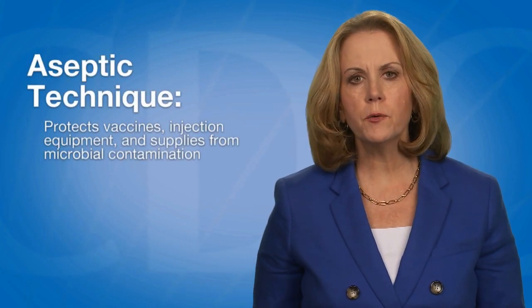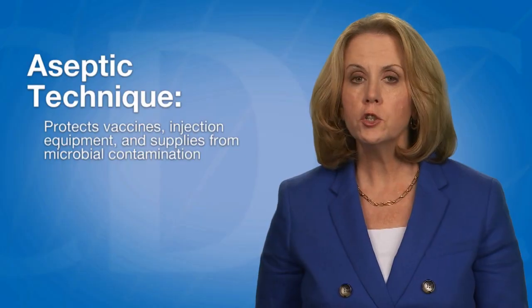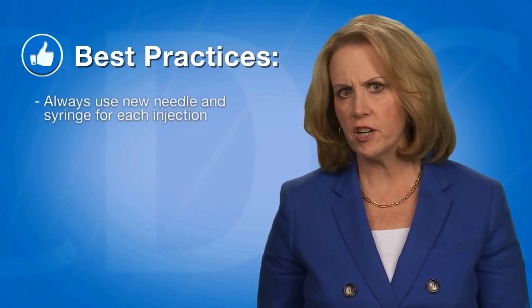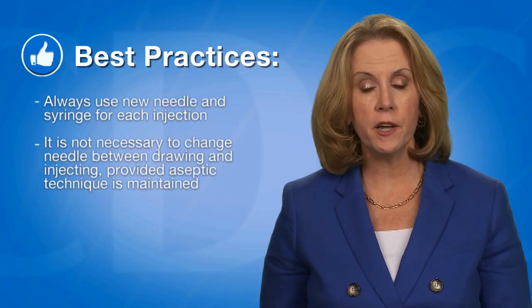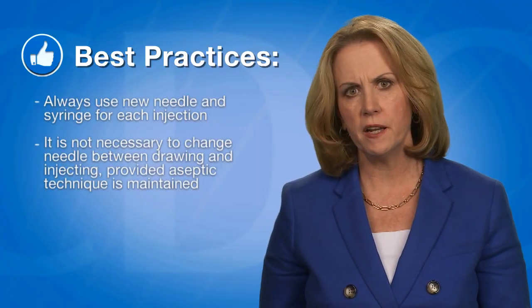Aseptic technique refers to the handling, preparing, and storing of medications and injection equipment and supplies to prevent microbial contamination. Always use a new needle and syringe for each injection. It is not necessary to change needles between preparing and drawing vaccine from a vial and injecting it into the patient unless the needle has been damaged or contaminated.